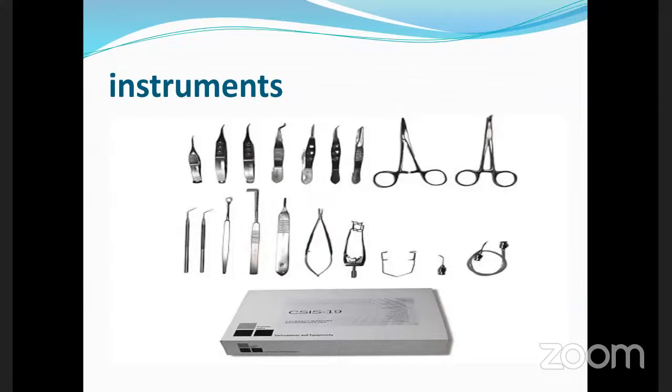Instruments, I have just shown this list. Just be prepared to keep all the instruments, because when you are doing daily phaco, then you realize the set doesn't have a superior rectus or something, if you are daily going for a phaco surgery or a femto surgery. So if you know that this is a case where you can land up with extracapsular cataract surgery, or you need to change it to SICS, just be sure that you keep all the instruments ready. And like the Simcoe cannula, you may find the Simcoe cannula has become very rusted, or it has not been cleaned for a long time.